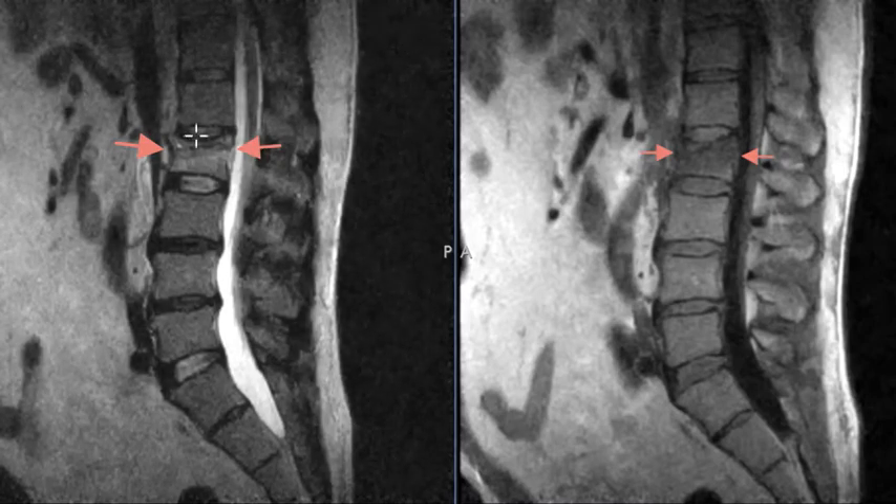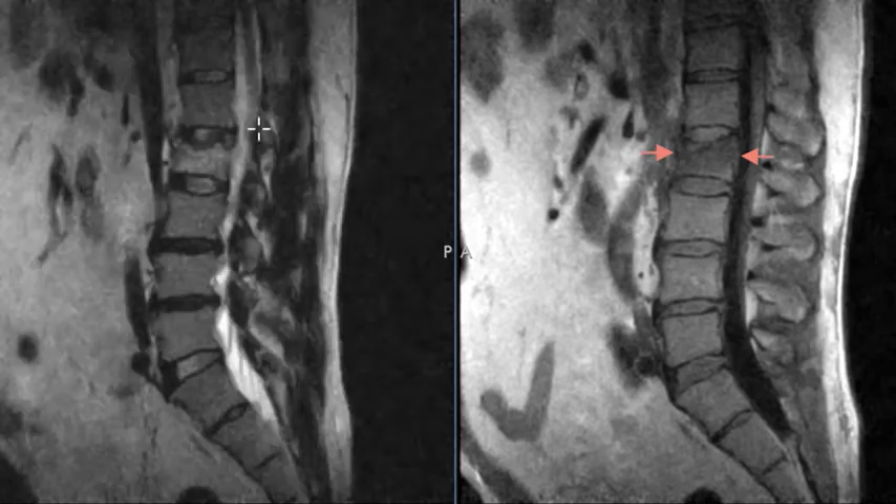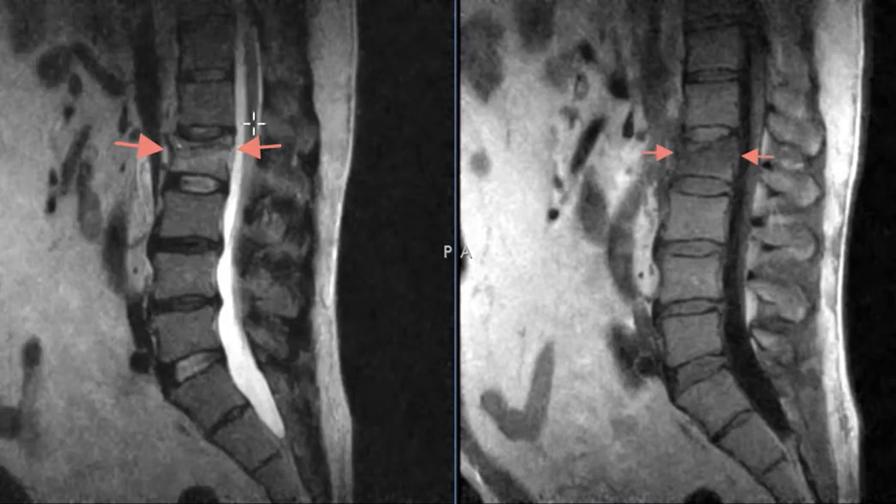What we look for with these is whether it's mild, moderate, or severe, and also whether the bone is nice and straight along the back surface or whether there is posterior bony retropulsion — does the bone jut backwards and push on the spinal cord? Here's the spinal cord. The back border of the vertebral column is nice and straight, so there's no posterior bone retropulsion. There's just a little bit of volume loss, so just a mild compression deformity here.